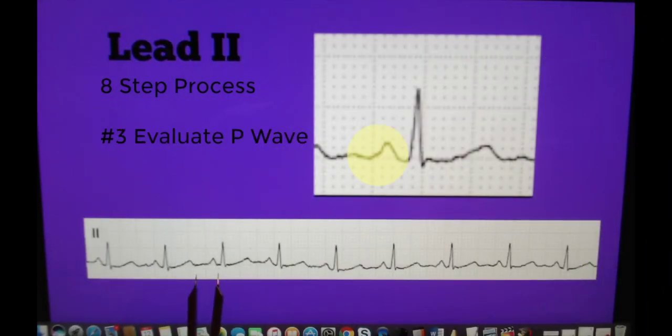In step three we are now evaluating the P wave. We want to look at all of the P waves in our six second strip. And here we see that they are round, upright, and they do come before a QRS complex.